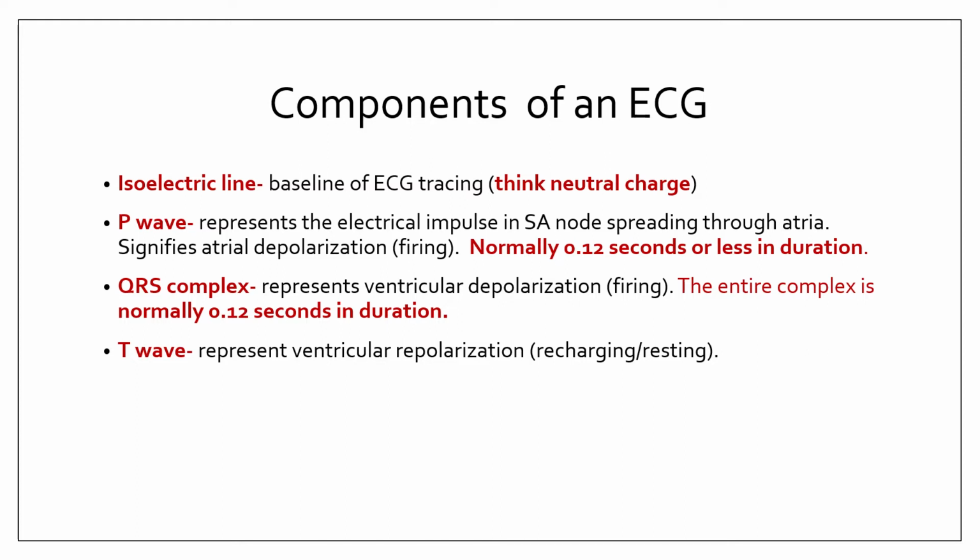The T wave represents ventricular repolarization. This is the electrical recovery phase that we were talking about, when ventricular cells reset in preparation for the next beat. This allows the ventricles to relax and refill. Any abnormal T wave changes may indicate ischemia, potassium imbalance, or effects of medications. And there is no visible atrial repolarization wave because it's hidden inside the QRS complex.